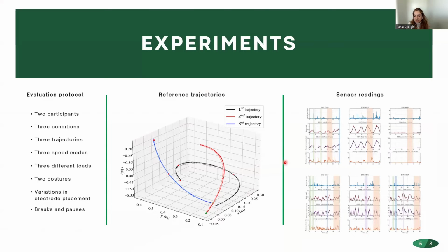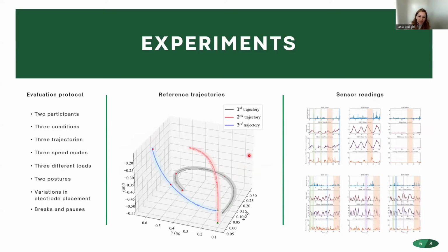We evaluated the system with the help of 2 participants. These participants were instructed to follow 3 reference trajectories that were shown to them on a computer screen, and they were instructed to not exceed the boundaries, which is a 2 centimeter radius of the reference trajectory.